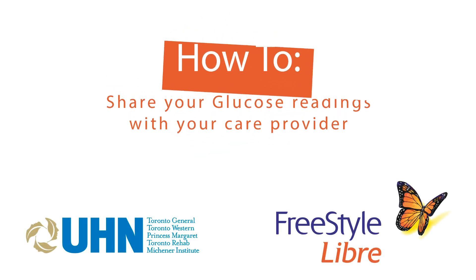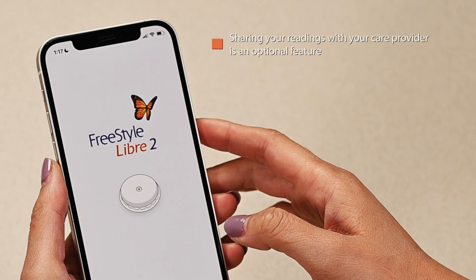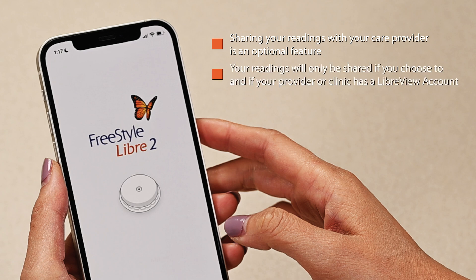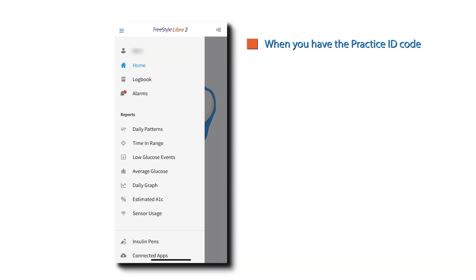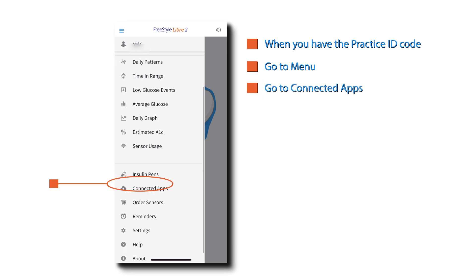How to share your glucose readings with your healthcare provider. Sharing your readings with your care provider is an optional feature. Your readings will only be shared if you choose to and if your provider or clinic has a LibreView account. Ask your provider if they have a practice ID code. When you have the practice ID code, go to menu.